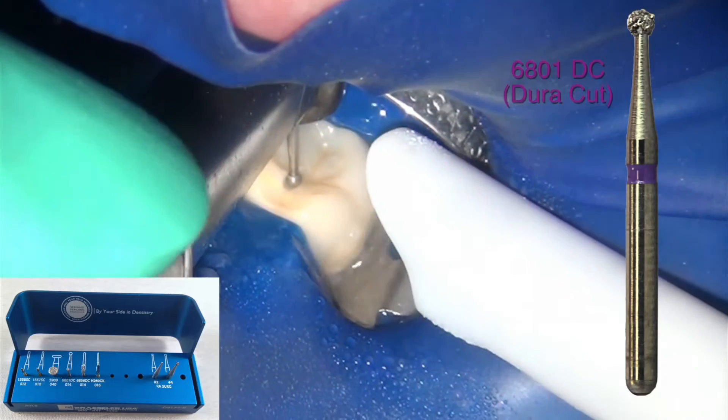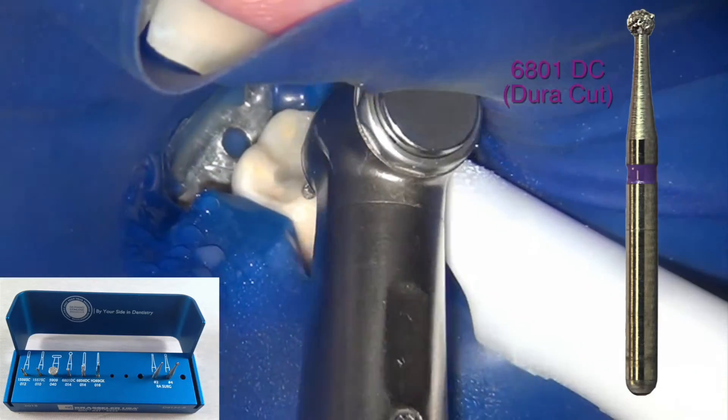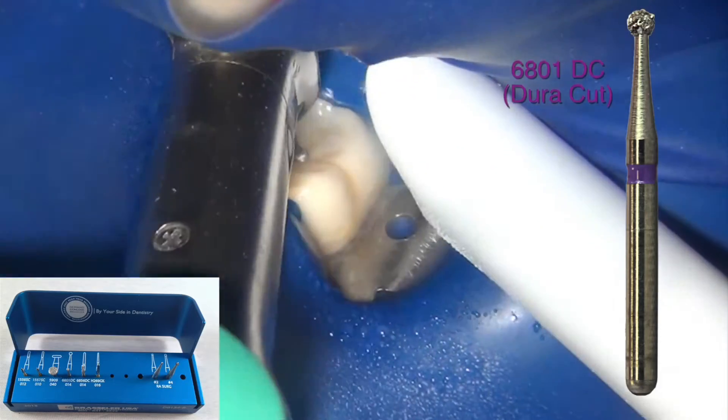The diamonds are bonded much more strongly to the surface of the burr than traditional diamonds, and therefore they can withstand the surface hardness provided by these modern materials.